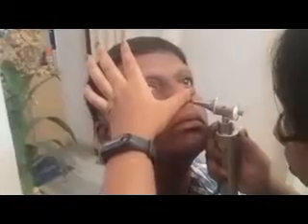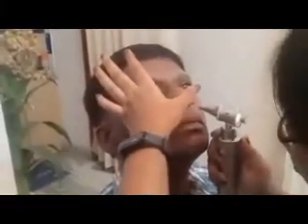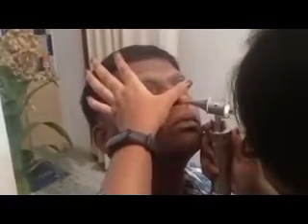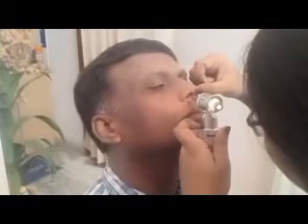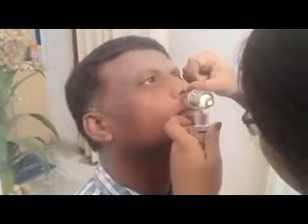I insert the speculum carefully, avoiding contact with the sensitive nasal septum. I hold the otoscope handle to one side to avoid the patient's chin. For the nose examination, we noted normally the nasal mucosa is redder than the oral mucosa and displays no swelling, exudates or bleeding, or any deviation, inflammation or perforation of the nasal septum.